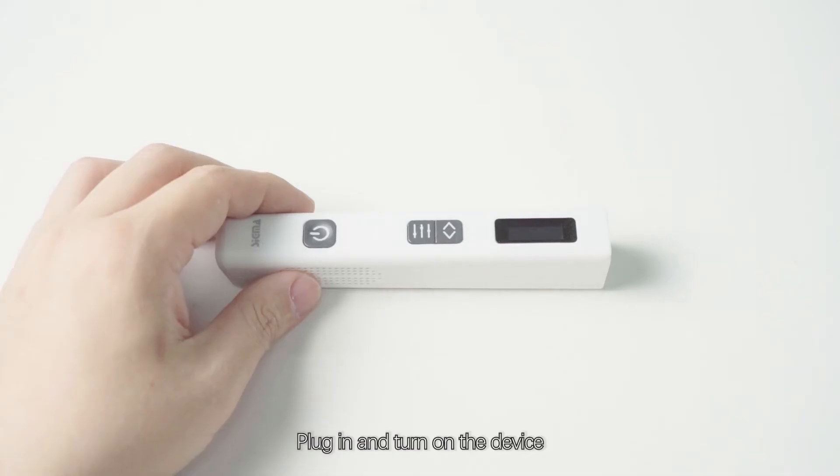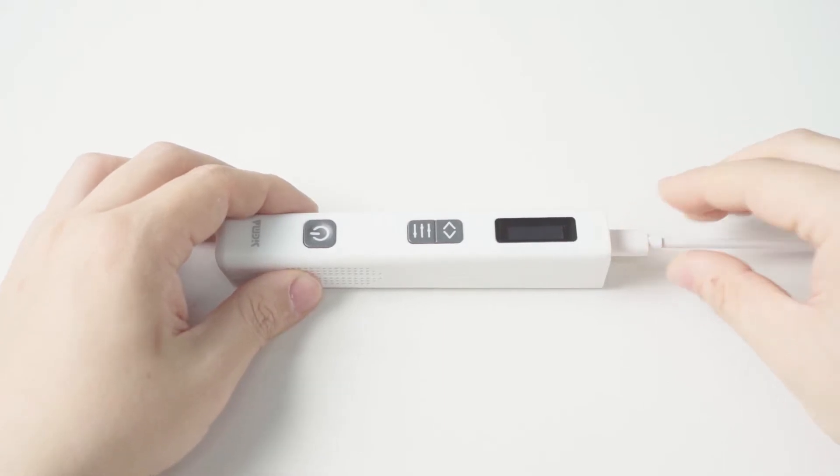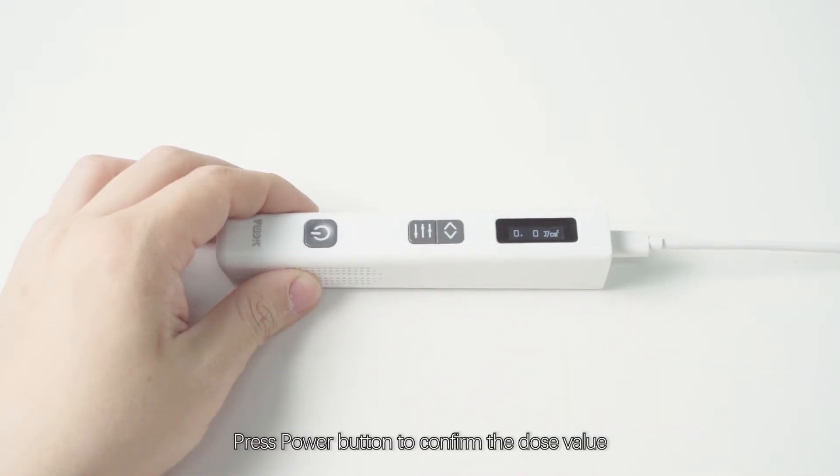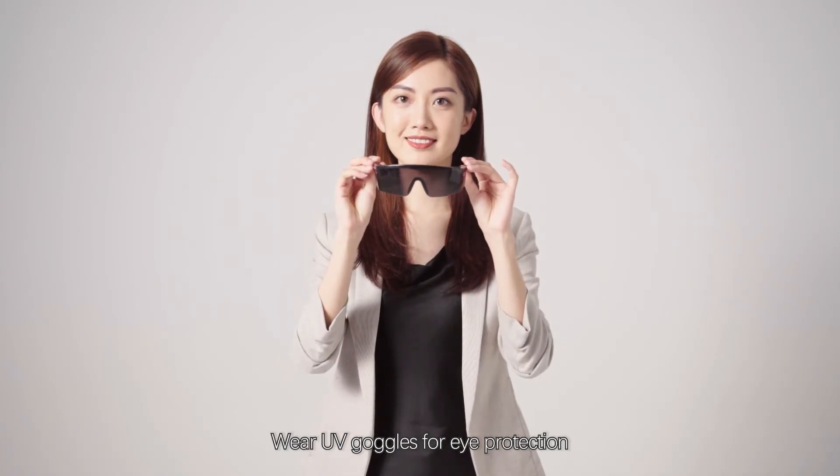Plug in and turn on the device. Press the function buttons to set the initial dose for Vitiligo: 0.1 joule per square centimeter. Press the power button to confirm the dose value. Wear UV goggles for eye protection.